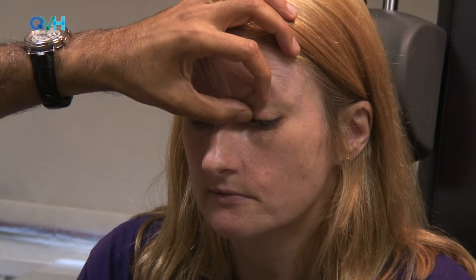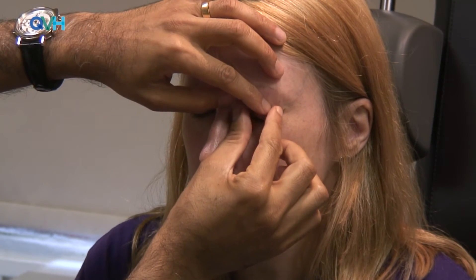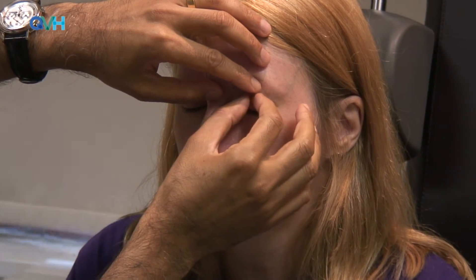The patient is observed blinking as well as in gentle and forced closure. If the eye rolls up, this is not a blink — this is gentle closure. The patient is asked to look down so that the pre-tarsal or flat part of the upper eyelid is exposed. The weight has to sit on the flat part directly overlying the cornea. The upper eyelid skin is stretched upwards from the brow. The weight should not be placed too low and should be placed relatively high at the level of the skin crease so that it does not overhang onto the eyelashes.